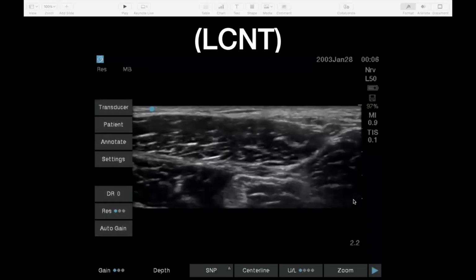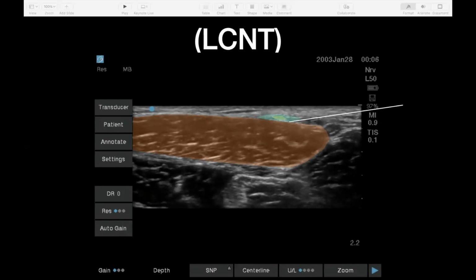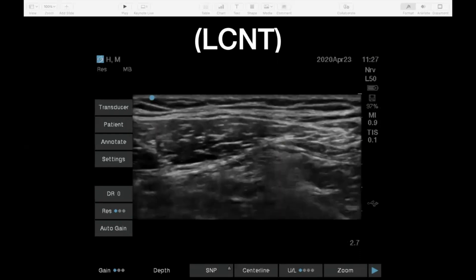So this is a still image of the same leg with the nerve up here somewhere on top of sartorius. It's normally just above the lateral border of sartorius in this little triangle. And then I bring the needle in from the right side and put some local around that nerve. You'd only need a few mils, maximum maybe 5 mils, and that would be plenty because it's such a small nerve. Again, a different leg, just showing the same thing.